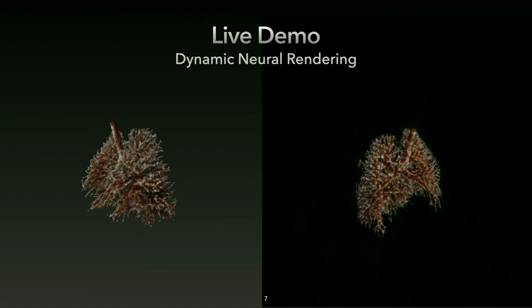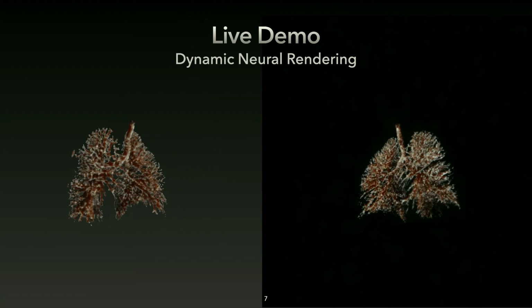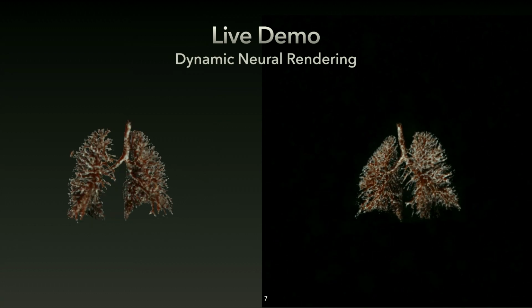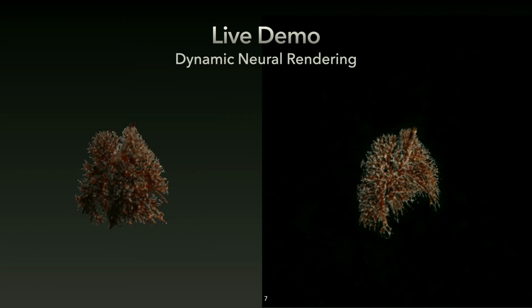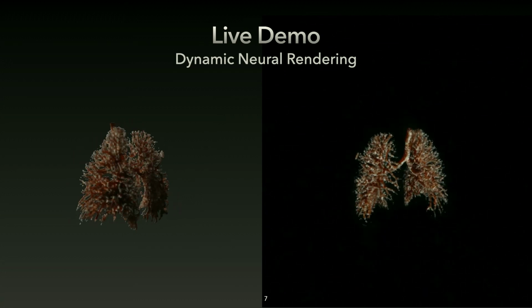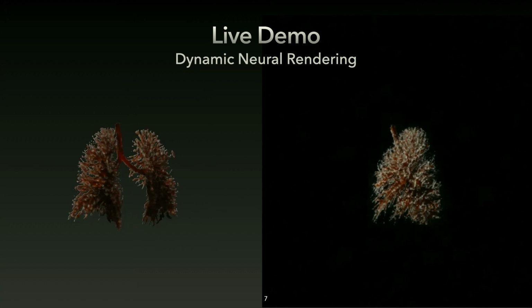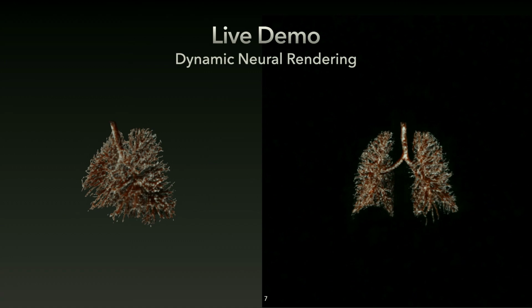On the left side, you have the reconstruction. For people who have worked with reconstruction methods, it might look familiar, a rotating table view, right? But on the other side, when the lung is breathing, like you see on the right side, sorry, hopefully it's possible to be seen, but it's very fine, it's basically moving. And this movement is encoded as well into the model, which is, again, modularly separated from the whole concept.